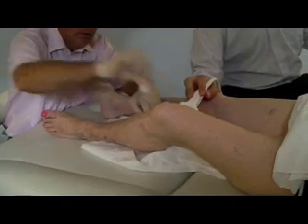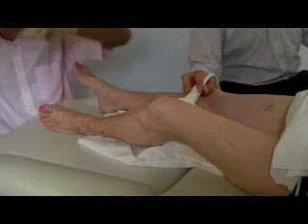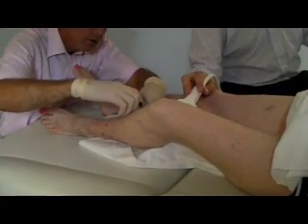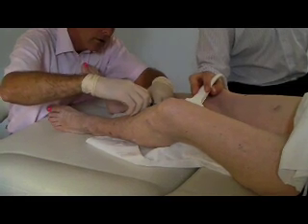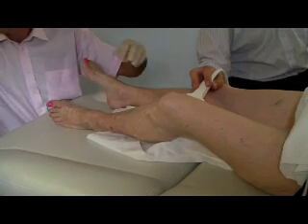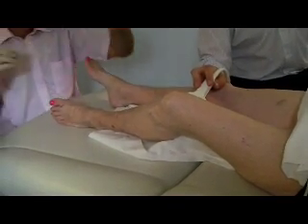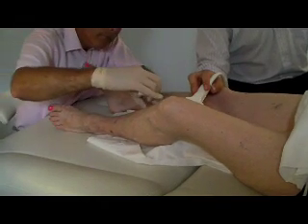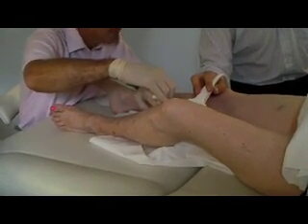The skin is cleaned with some antiseptic and then a very fine needle is used to put some local anaesthetic into the skin to freeze it, and then allow the doctor to pass into the faulty vein a small tube. In this case the doctor is using something called a Venflon, which is the same kind of tubing that is used when people have a drip.